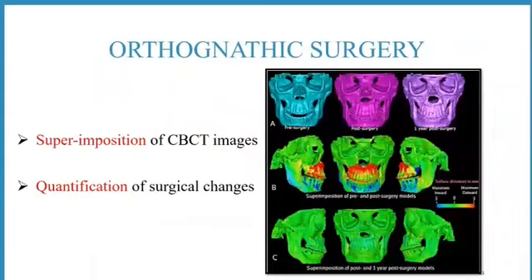Almeida et al. in 2011 stated that CBCT volume-derived virtual facial models evaluated post-surgical changes in the soft tissue overlying the mandible in response to mandibular advancement surgery. They superimposed the virtual models of the cranial base and used colored maps to quantitatively evaluate the surgical and post-surgical changes.